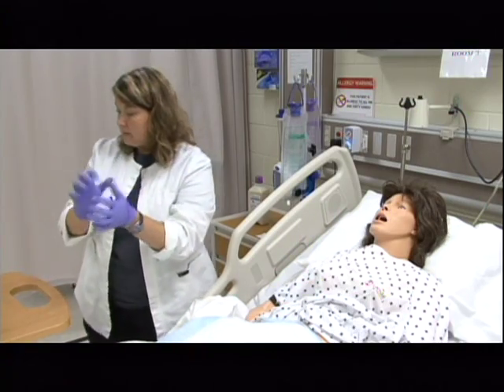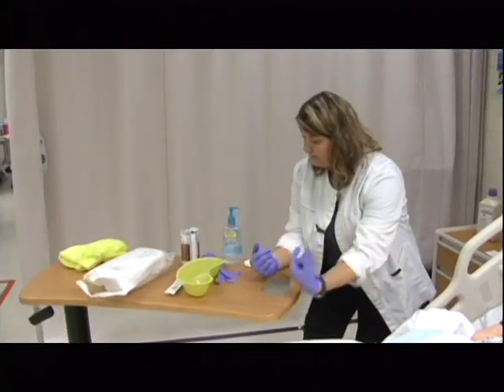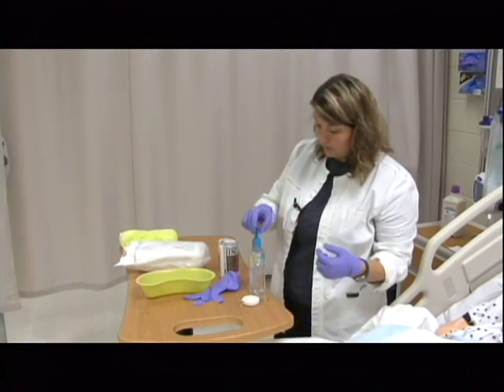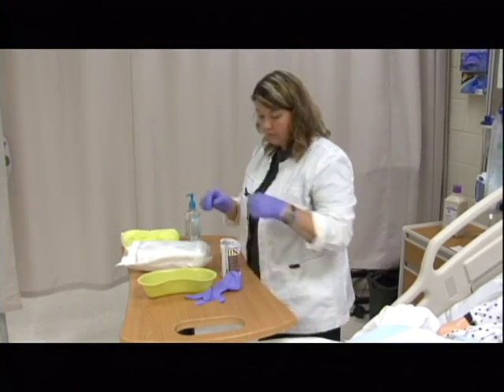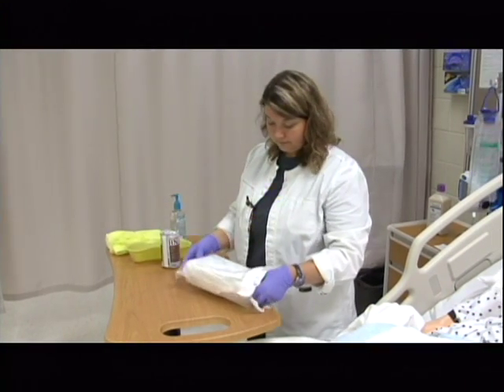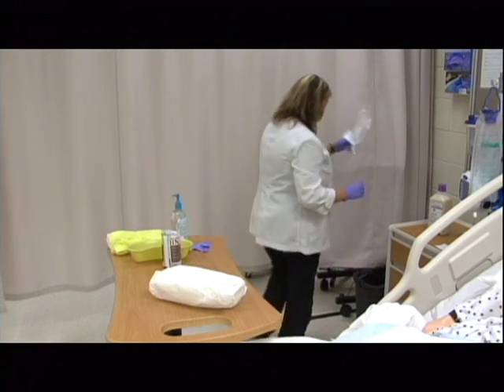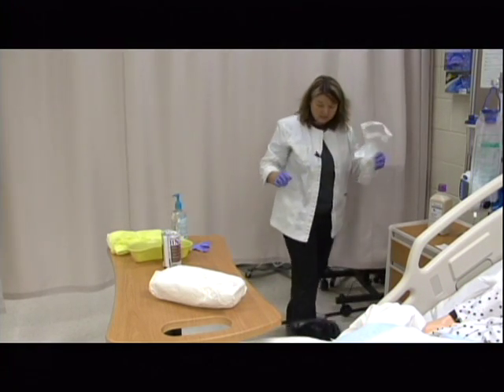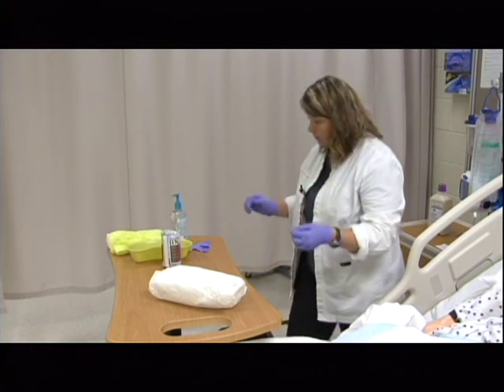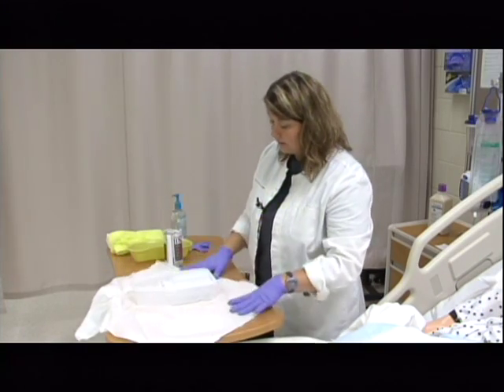So what I'm going to go ahead and do, I'm going to move the table around here for my use, and move my equipment around so that I can get to what I need to get to. So the personal protective equipment and these other things I can move. I'm going to go ahead and open up my piston irrigation tray set. If I do not have my trash can over here already, I can go ahead and move this with my feet. If you end up having to touch the trash can, then please make sure that you take your gloves off, refoam.